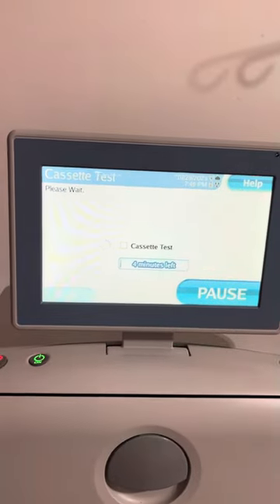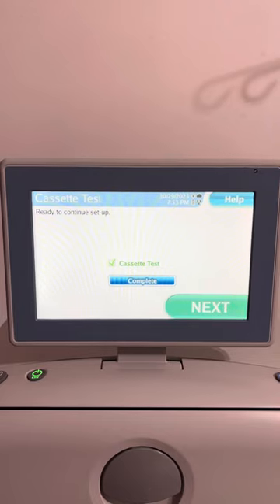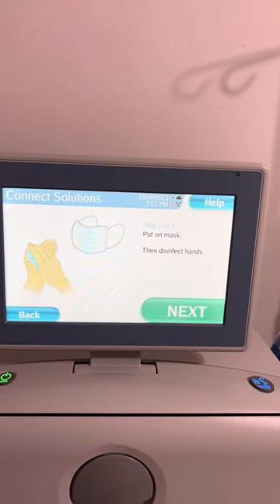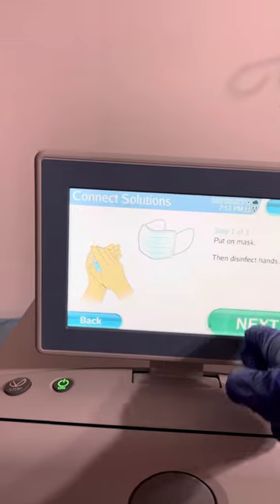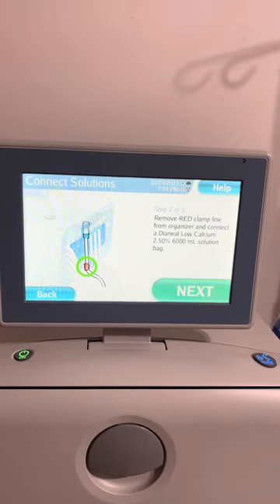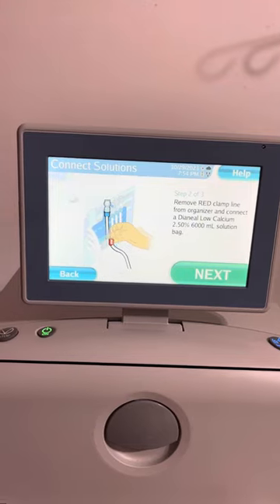The system is testing the cassette, please wait. Cassette test complete. Put on mask, then disinfect hands. As you notice, the machine keeps telling you to wear a mask and disinfect, and connect to the prescribed solution bag — it said this several times.